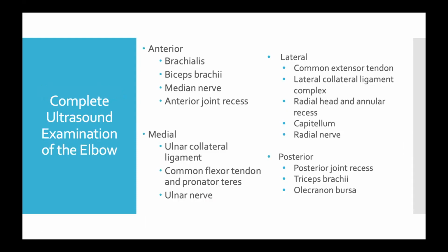So that kind of rounded out the majority of our anterior ultrasound examination. We saw our median nerve in the home base view, and as it came into view, when we glided more proximal to distal, you can evaluate it in that. What I did not include was a long axis view of that.